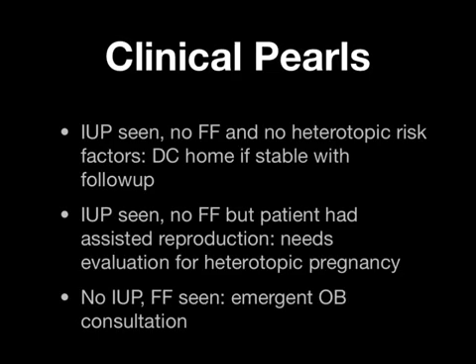So remember, focus at this point on intrauterine findings both transabdominally and transvaginally, as well as cul-de-sac findings. In future modules, we're going to build on how to evaluate the adnexa more successfully.